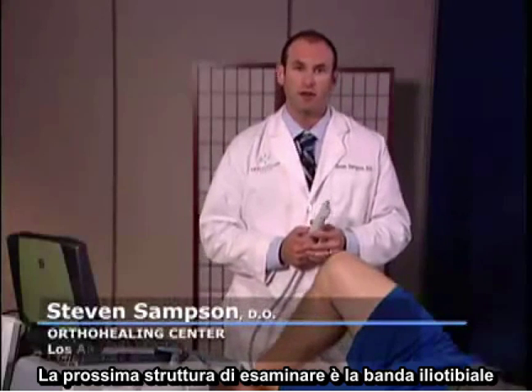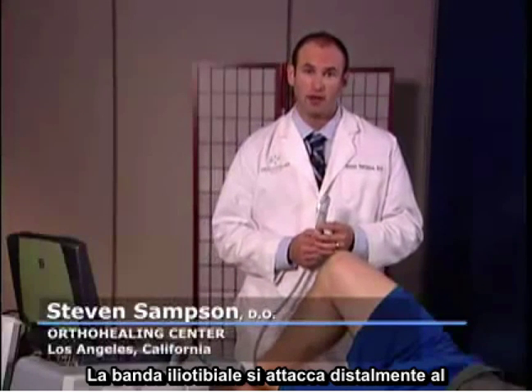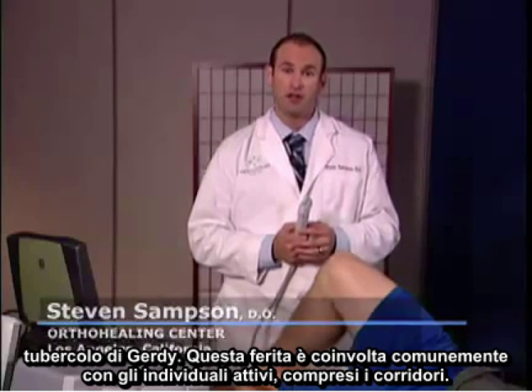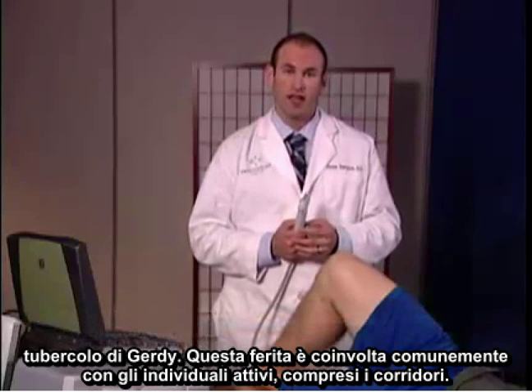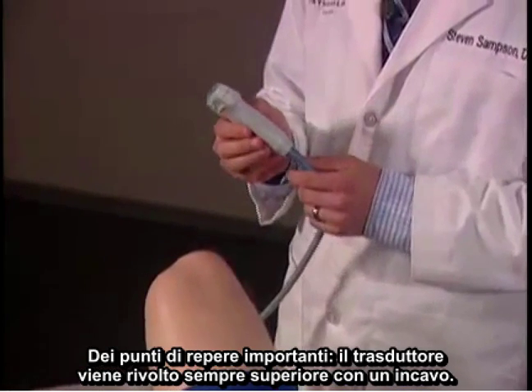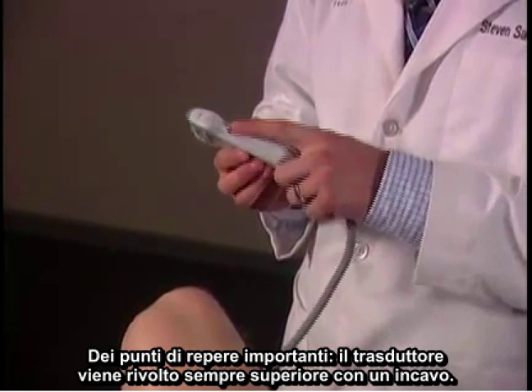The next structure to examine is the iliotibial band. The iliotibial band attaches distally at Gerdy's tubercle. This injury is commonly involved in active individuals including runners. Important landmarks: the transducer will always face superior with the notch.